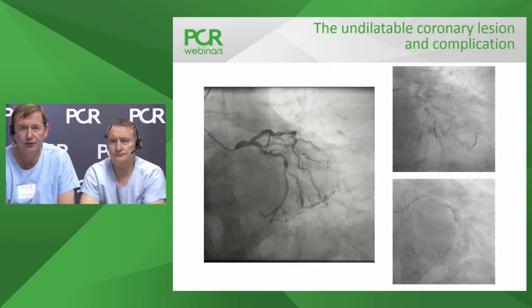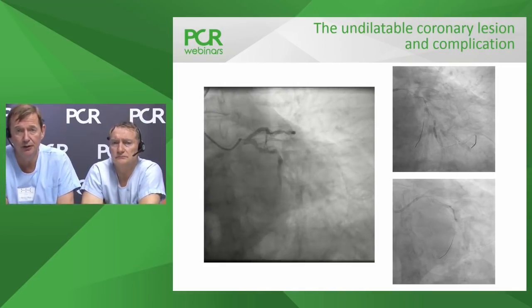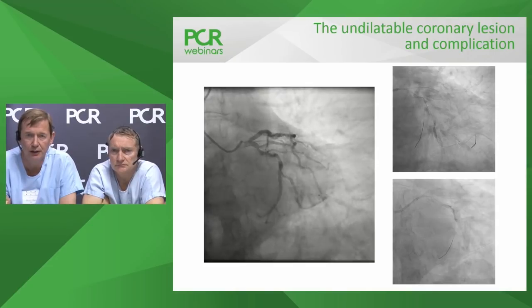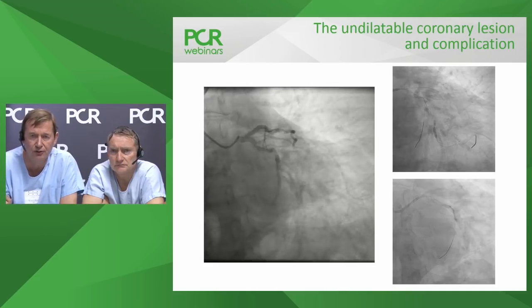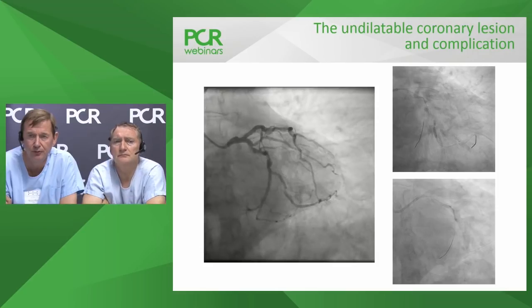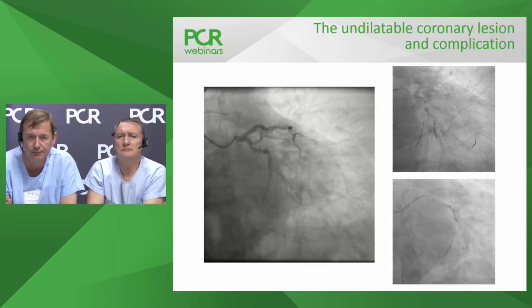Okay, this is a case done, in fact, by the unit in Toulouse here, and it was transferred in the last couple of weeks or so, where you can see the angiogram of a very tortuous calcified ostial obtuse marginal, which was treated with balloon therapy. You can see some of the intervention on the right-hand slide.